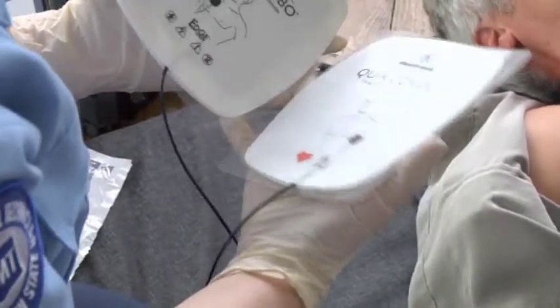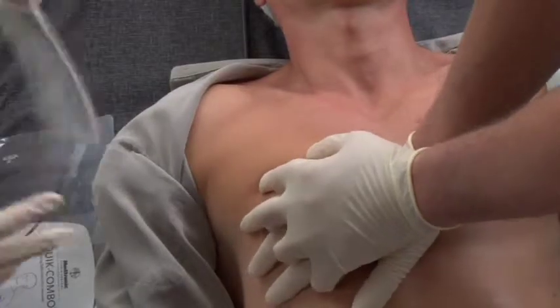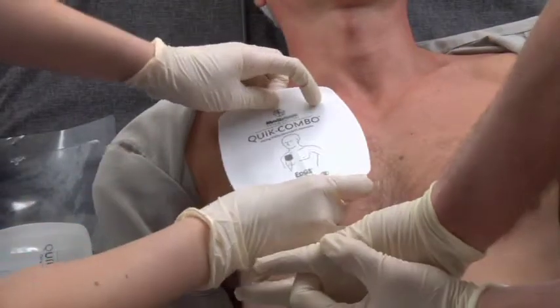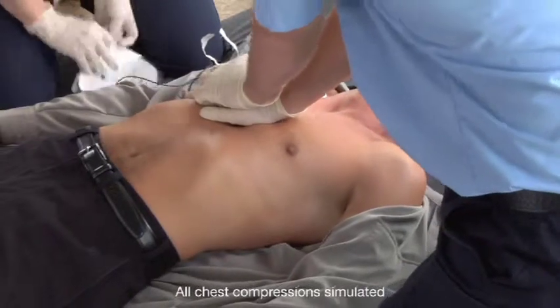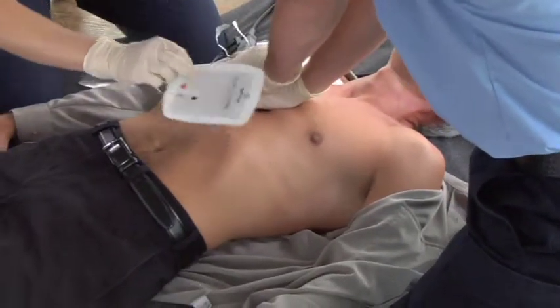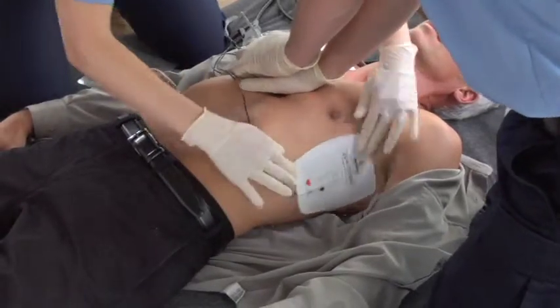Place the electrodes in the anterior lateral position as shown in the picture on the back of the electrodes. Make sure the electrodes do not touch each other, lead wires, ECG electrodes, dressings, or medication patches. Be sure the entire electrode surface adheres to the skin. Place electrodes away from implanted devices if possible. Use fresh electrodes if you have to reapply them.